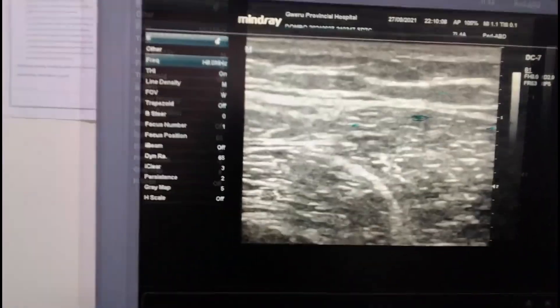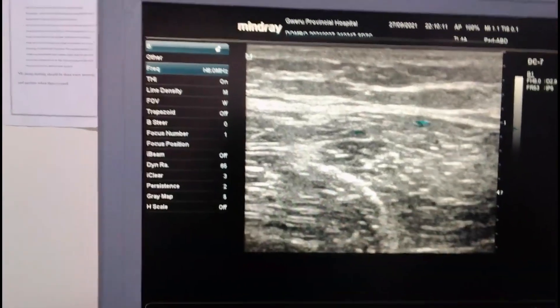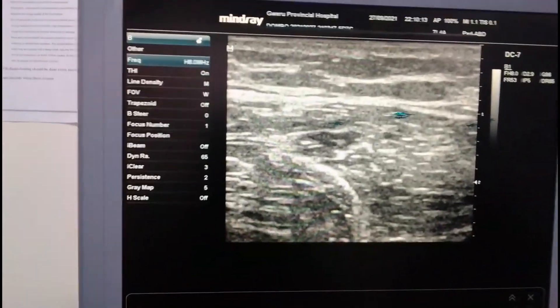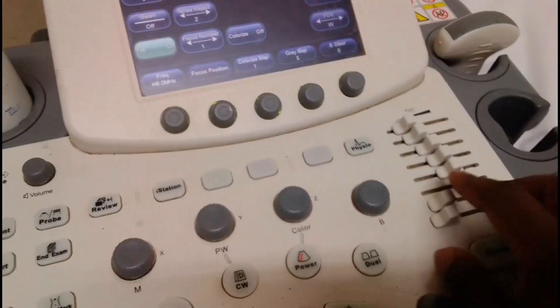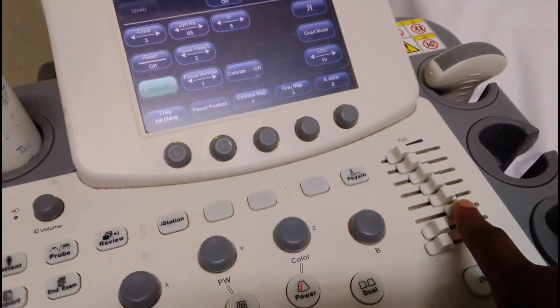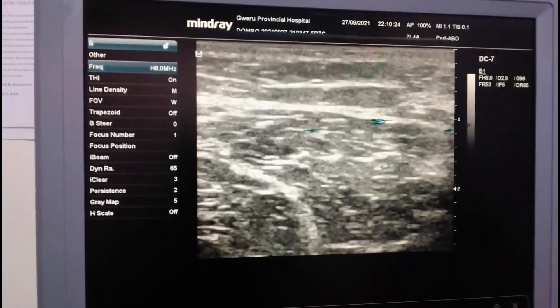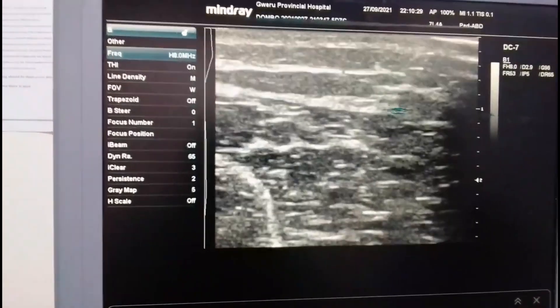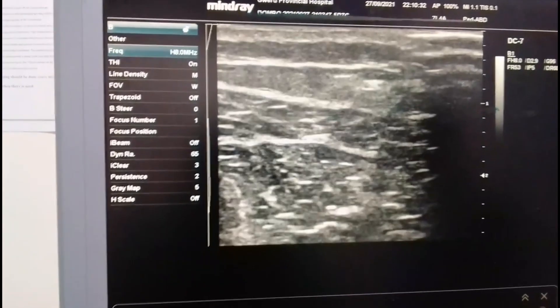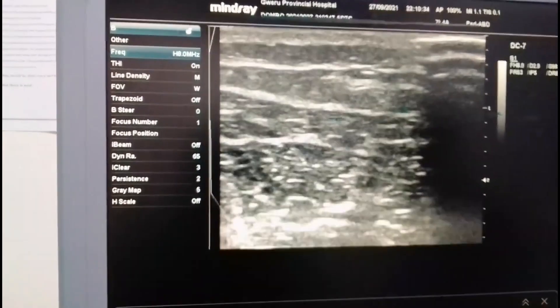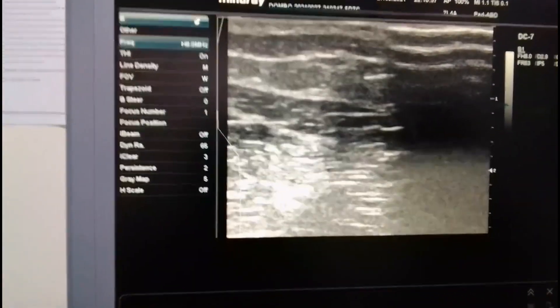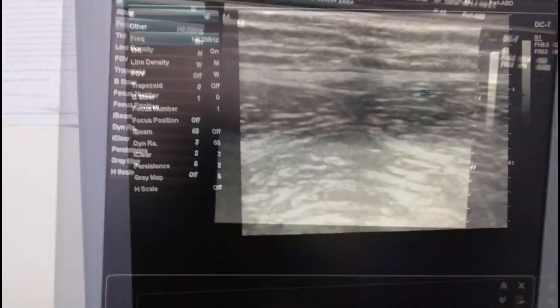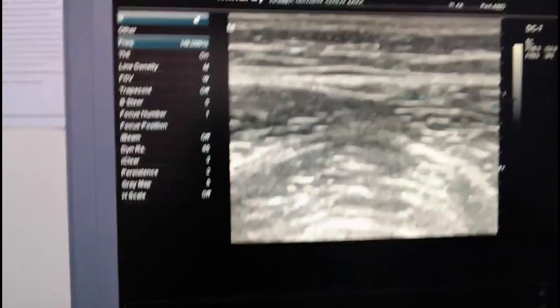I need you to look at the image and see how the change of these keys is going to have an effect on image quality. I am now shifting the lower TGC keys — let me move these lower keys first and leave the others as they are, so see what is going to happen on the machine. I am moving them back — you can see from below, as I move them, it is becoming more bright.